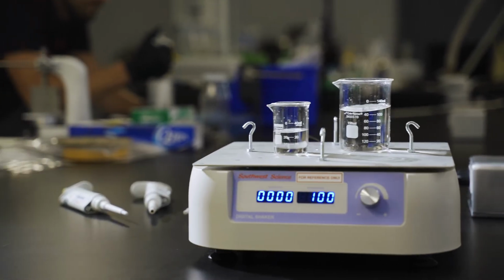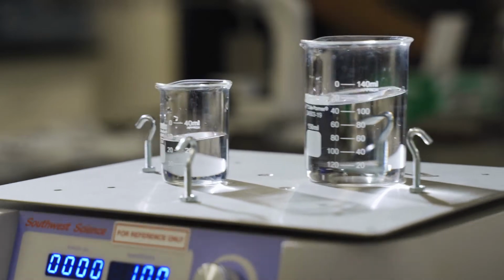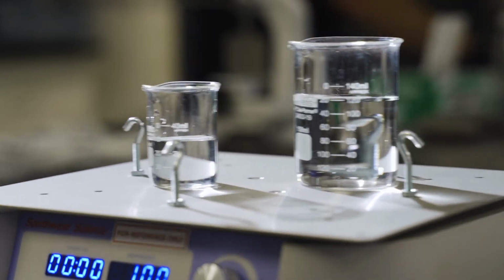And so part of the -2 standard, the particulate standard, is measuring the emissions of those particulates, quantifying the concentration of those particulates over time, and then comparing them to established health-based thresholds to ensure that that respiratory device isn't outputting anything that could be considered hazardous for the patient.